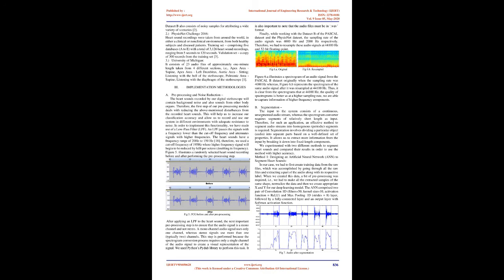In order to implement this functionality, we have made use of a low-pass filter, LPF. An LPF passes the signals with a frequency lower than the cutoff frequency and attenuates signals with higher frequencies. The heart sounds have a frequency range of 20 Hz to 150 Hz [18], therefore, we used a cutoff frequency of 195 Hz, where higher frequency signals will begin to be reduced by 6 dB per octave, doubling in frequency.